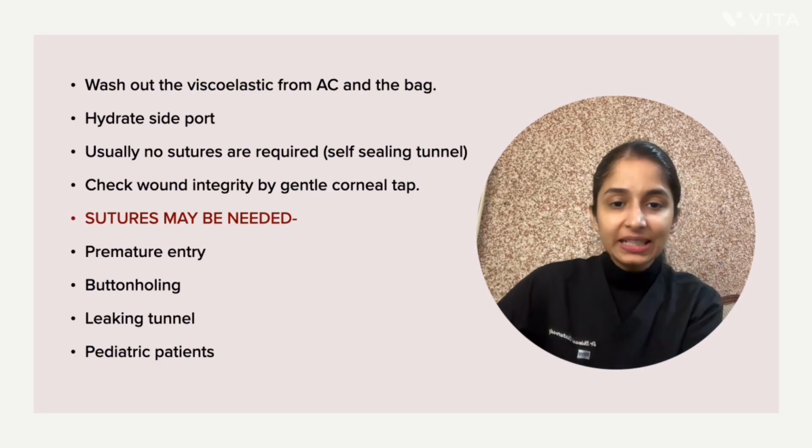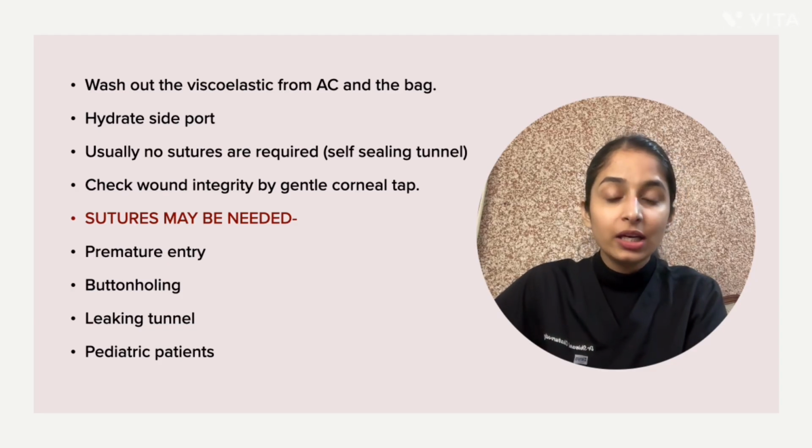Now for better understanding, I am adding a SICS video. Please go through it to revise and reinforce the steps we have just discussed.